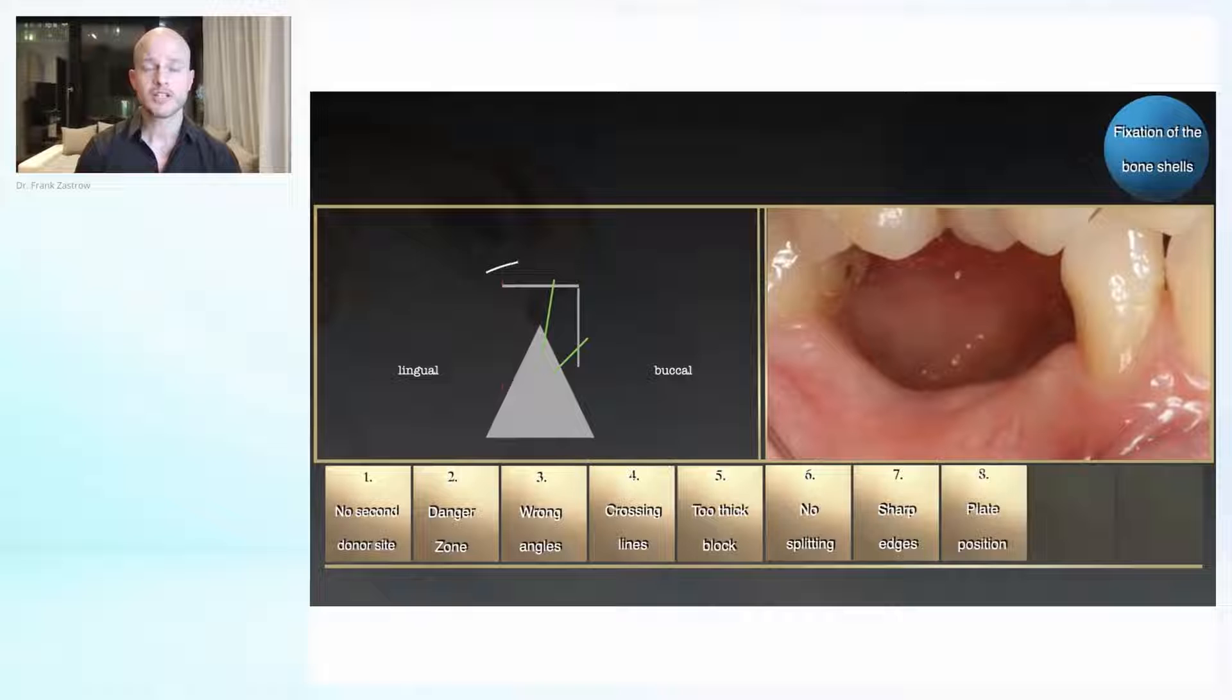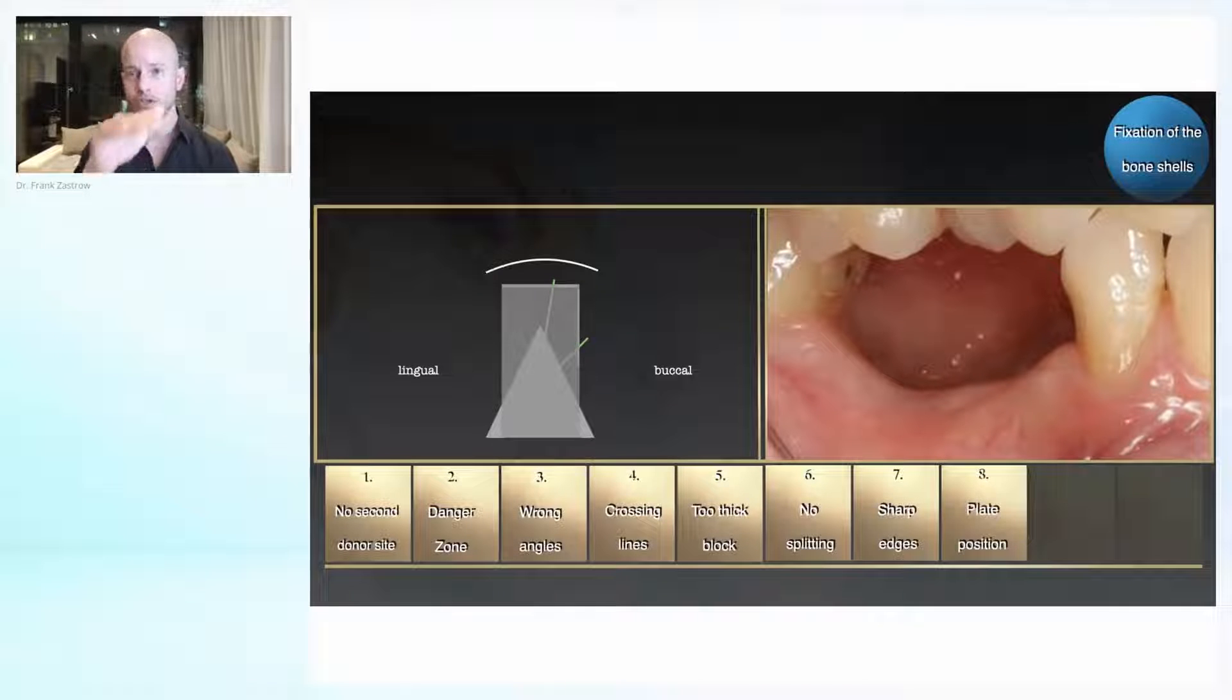Also, what is very important is when you have this nice support for the soft tissue, you should watch out that your plate—now look very carefully to the plate on the occlusal part—if this plate is changing the angle slightly, then you're creating an edge on one side and it can open up on that side.